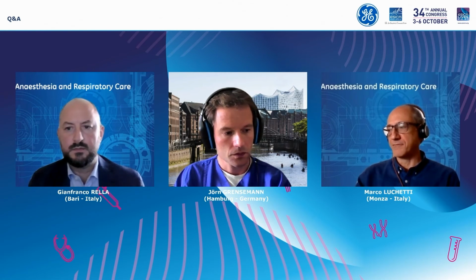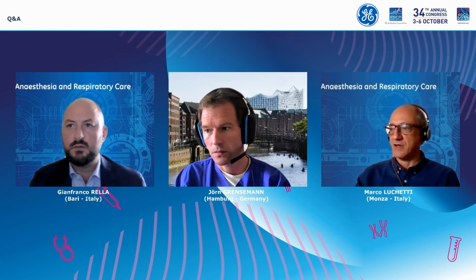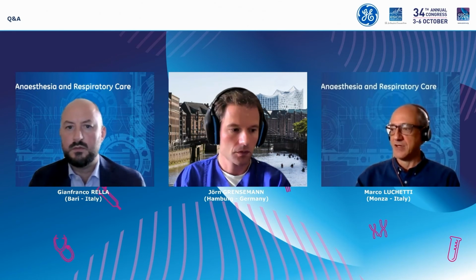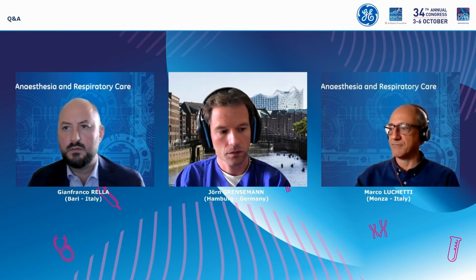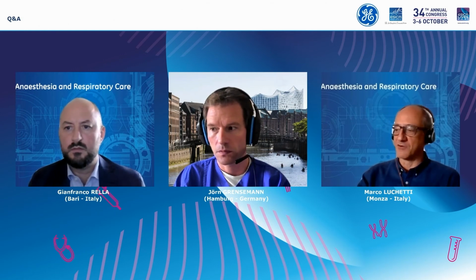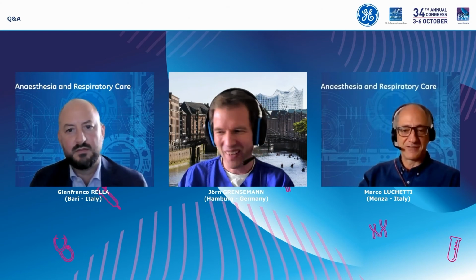One more question. There are ICUs where you usually insert Swan-Ganz catheters to measure cardiac output, and so maybe you can calculate nutritional assessment by using the oxygen uptake, the oxygen consumption. What do you think about this? It's a provocative question. Do we really need indirect calorimetry in those cases?